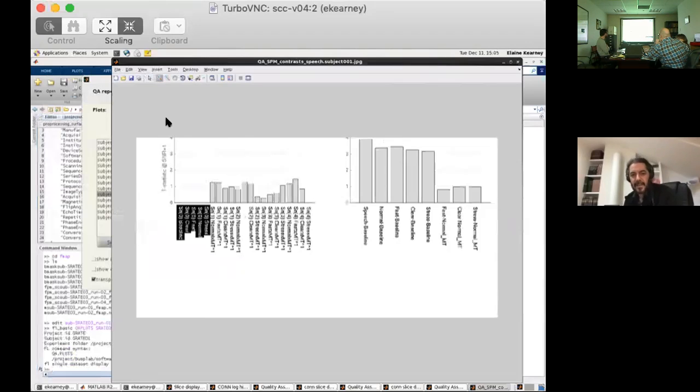So the thinking was, maybe we should get rid of the duration effect there. Or at least try the same plots for the same experiment without the duration correction, to evaluate to what extent the decrease in sensitivity that we see for the comparison of the conditions we care about, compared to the individual conditions versus baseline, is actually related to that.